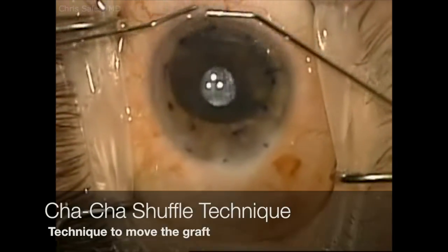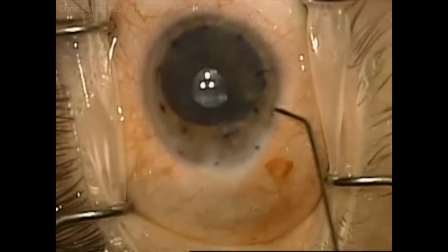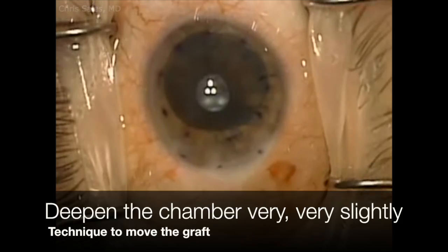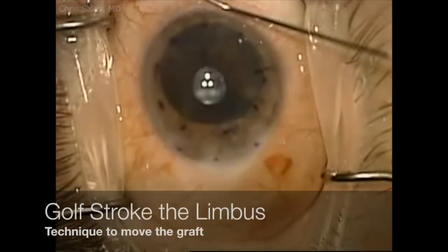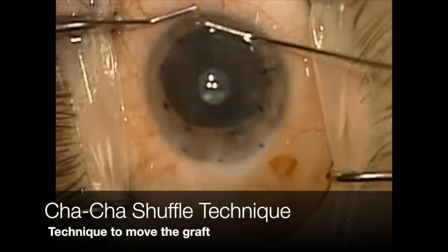Some quick maneuvers here to move the graft into the central marks, but the chamber is too shallow so I deepen it very gently and very slightly with a little bit of BSS. A few more golf strokes and cha-cha maneuvers, and eventually this graft is in the center of my marks.